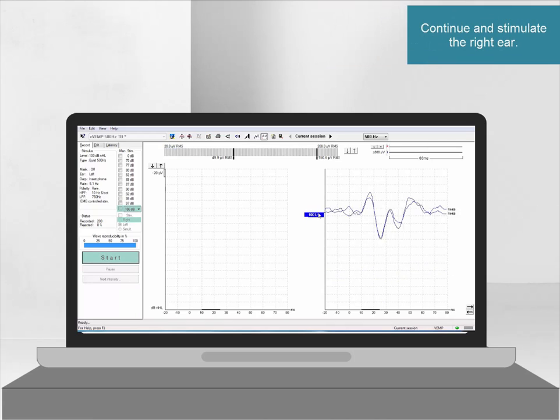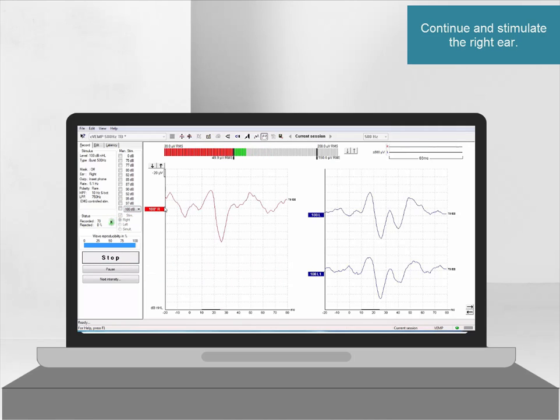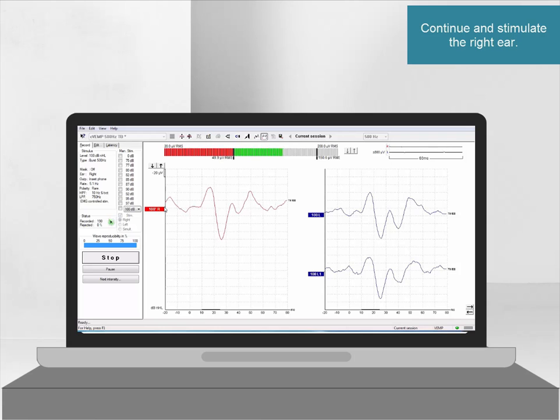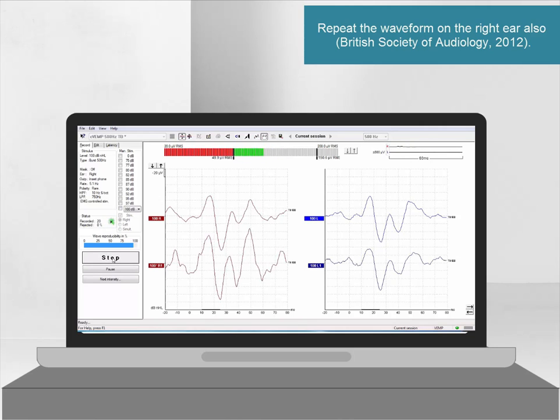After the test has been completed in the left ear, we continue and stimulate the right ear. We repeat the waveforms on the right ear just as we did on the left ear.